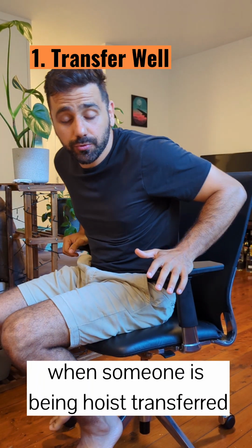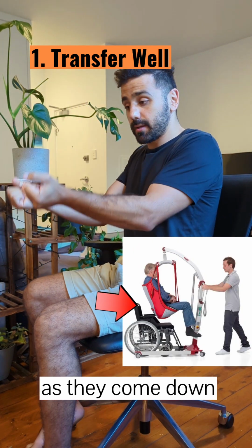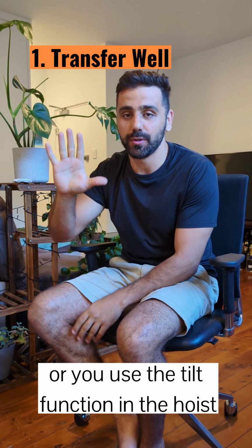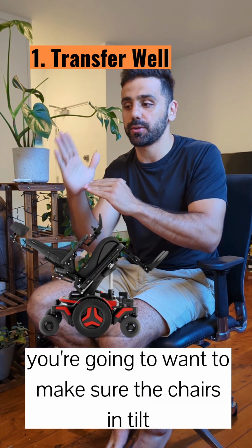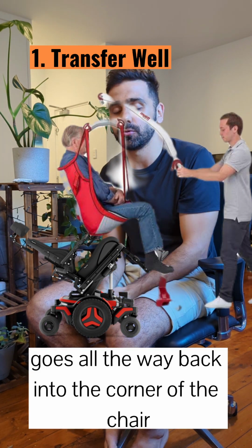When someone is being hoist transferred, there's two things you either want to do. You either want to hold onto those back straps as they come down to make sure the hips go all the way back, or you use the tilt function on the hoist and then lower them into the chair. If the chair has tilt, you're going to want to make sure the chair's in tilt as you lower them down to make sure the hip goes all the way back into the corner of the chair.